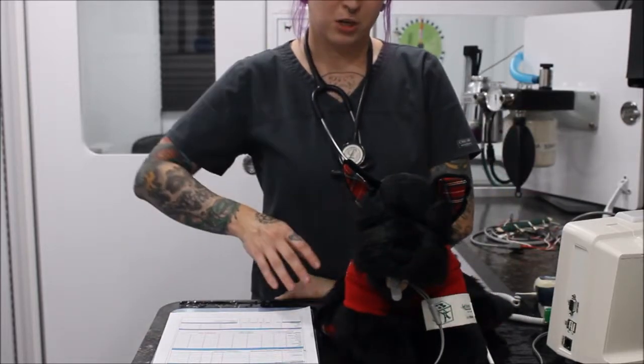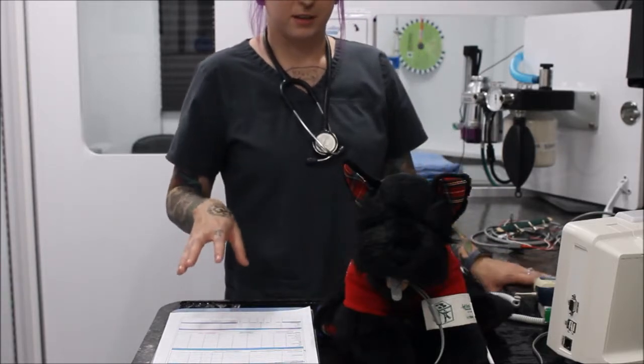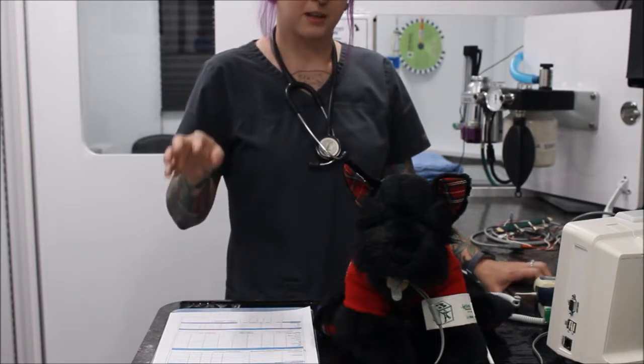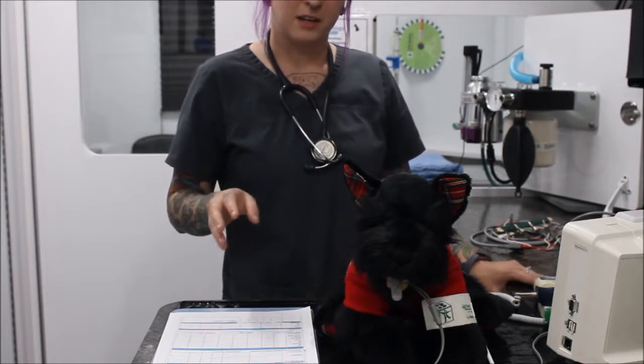For blood pressure, we want the systolic to be about 90 to 160, the diastolic to be 50 to 90, and the mean to be about 70 to 90.